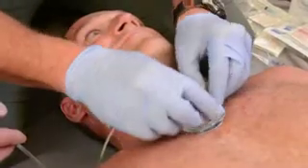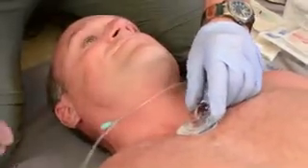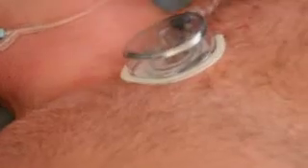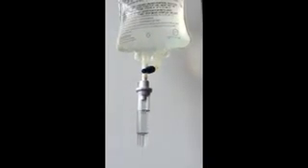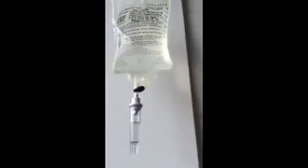Flow rates can be as fast or as slow as needed. While maximum flow rates in excess of 100 cc's per minute are possible, there is typically no need for such a high flow rate except in cases of severe trauma. The vast majority of EMS infusions, including cardiac arrest, arrhythmias, and most medical conditions, are less than 200 cc's per hour for a variety of reasons. However, as you can see in this example, a gravity-fed bag can flow at a very high rate.